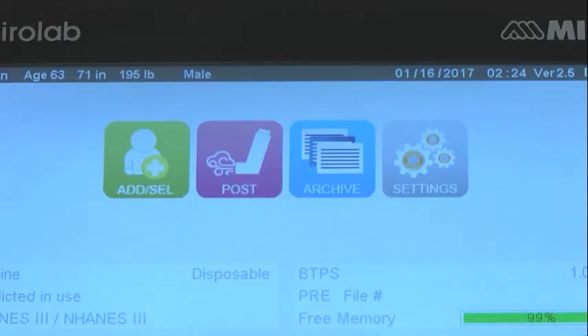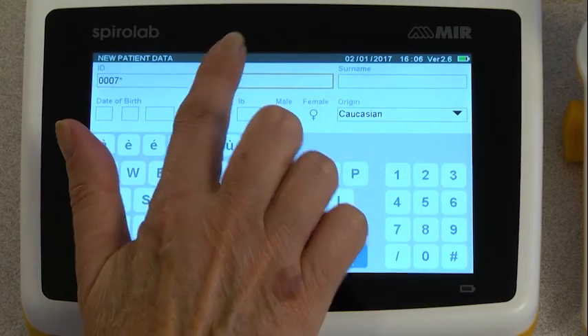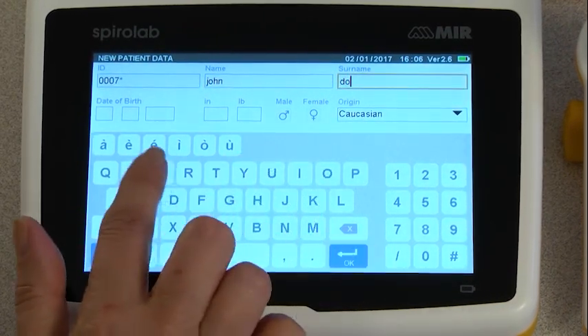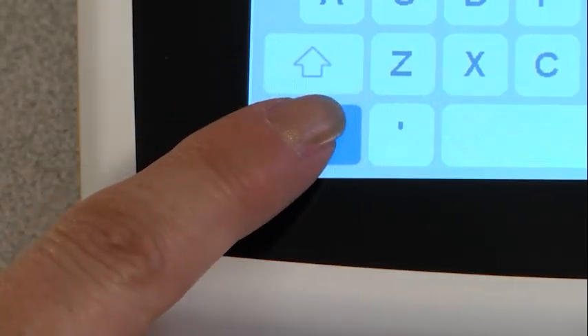To add a new patient, press the Add Select button. This brings you to a QWERTY keyboard where you can enter all of your patient's information. Once all of the information is entered, press Exit in the lower left-hand corner.